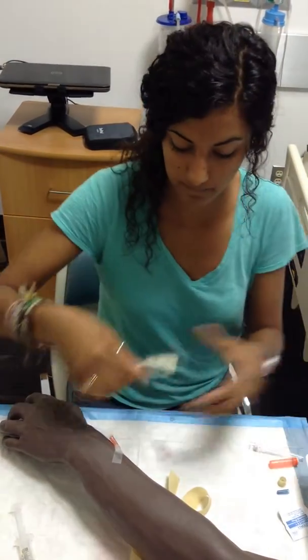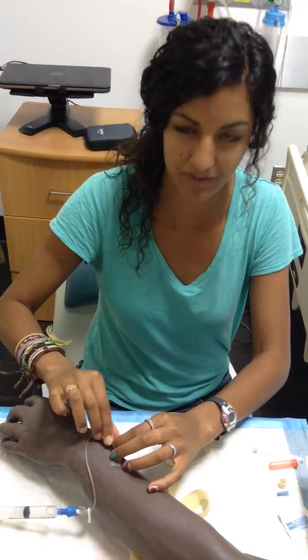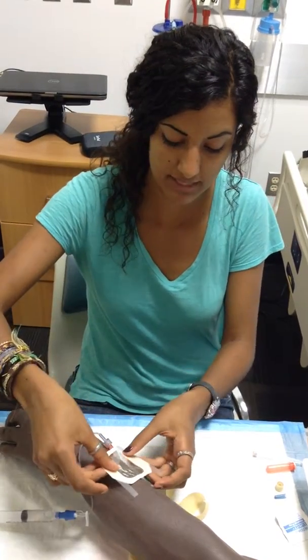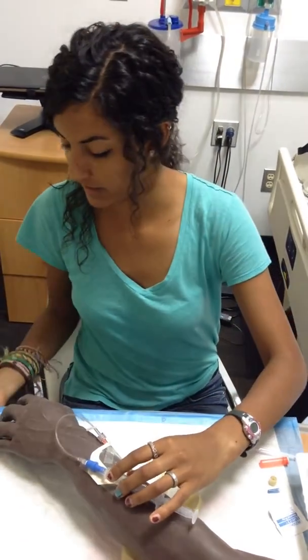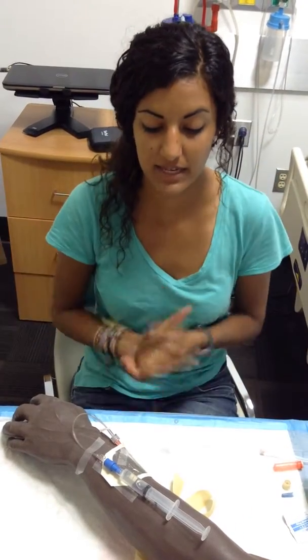Apply the Tegaderm. I would have connected this before I taped it in place. And I'll apply the Tegaderm, and I will date, time and initial, and then I will secure this in place. And now it is complete.